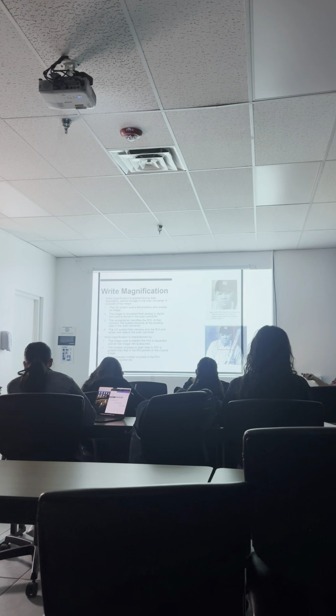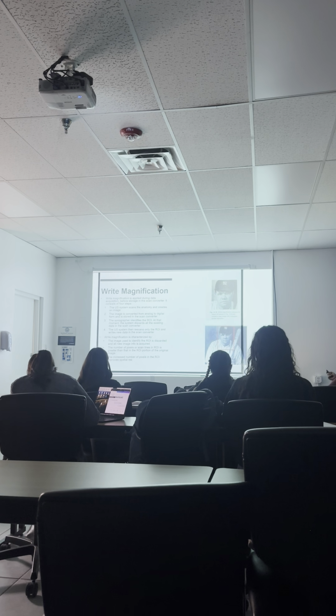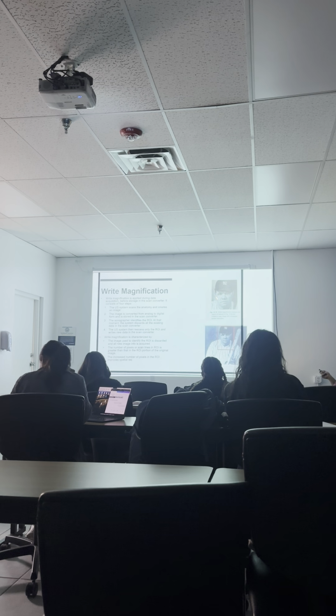Okay, so the number of pixels or scan lines in the region of interest is greater than that of the region of interest portion of the original image. So there's gonna be more pixels and more scan lines in this area than there was altogether in this whole image. The increased number of pixels in the region of interest improves spatial resolution. Now we can actually see the differences of shades of gray, so we can identify the mouth, the nose, and the eyes, the eyebrows and stuff, right?